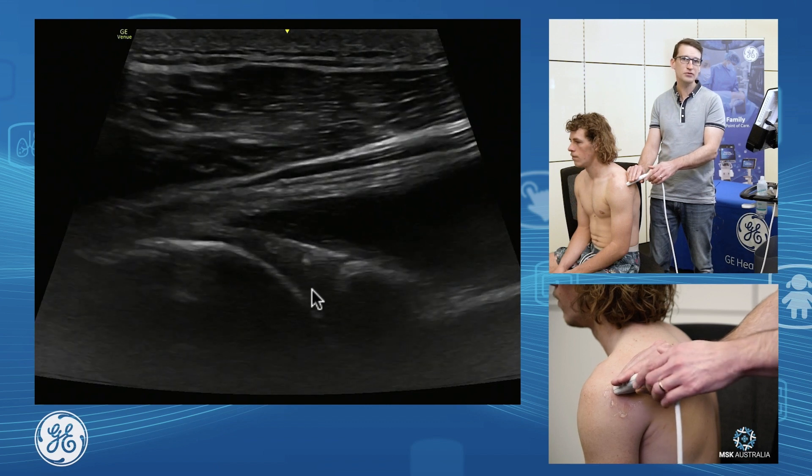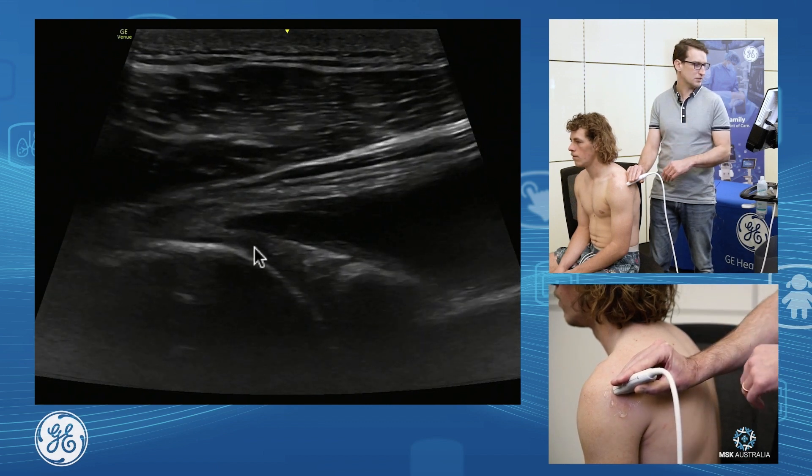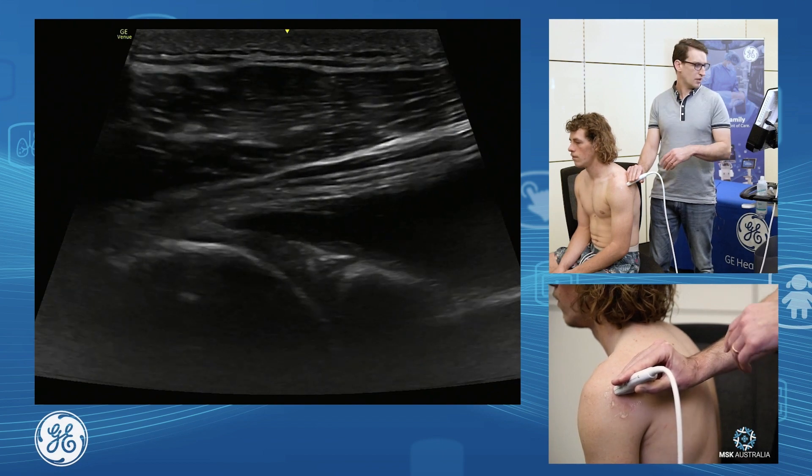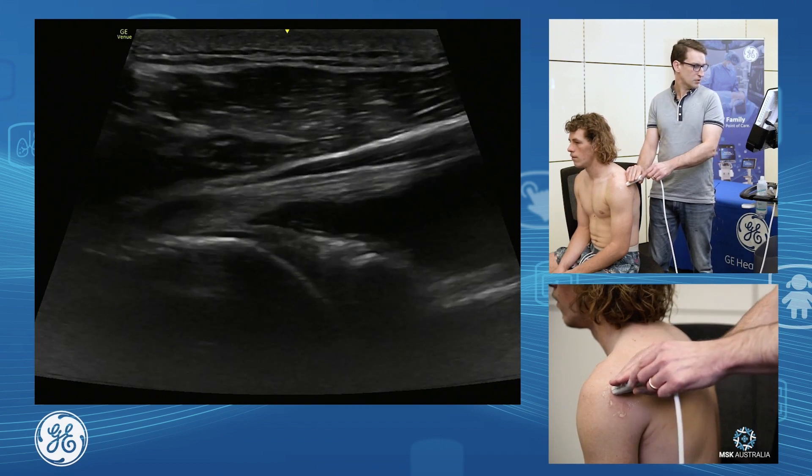And there we are. We've got our glenoid, labrum, and our humeral head with its articular cartilage. I want to assess the full superior to inferior aspect of this glenohumeral joint.